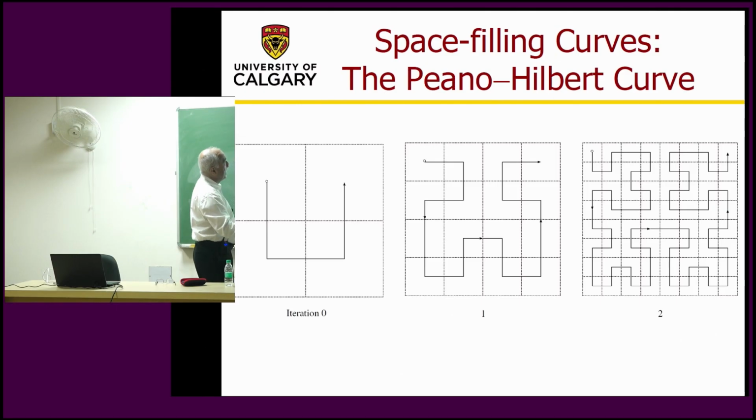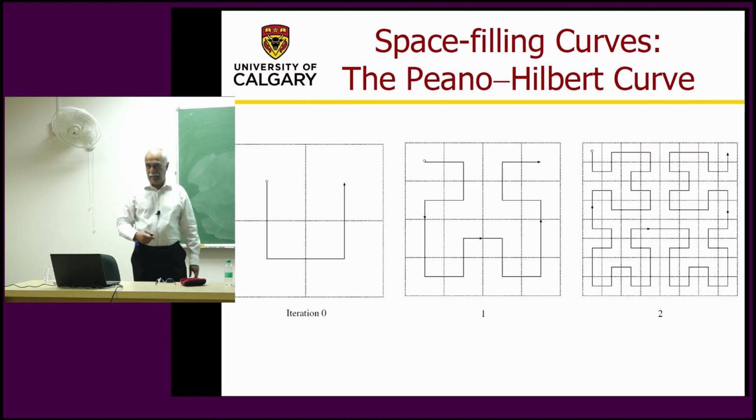So at different scales, you see this pattern. If you take this pattern, this is the same, turned around. And you come here, this pattern is the same as that. And this is the same, and that is this flipped. And that is this thing turned. So it is this pattern that appears repeatedly at different orientations and scales. And then you get these other more complex patterns. But this is called a space-filling curve.